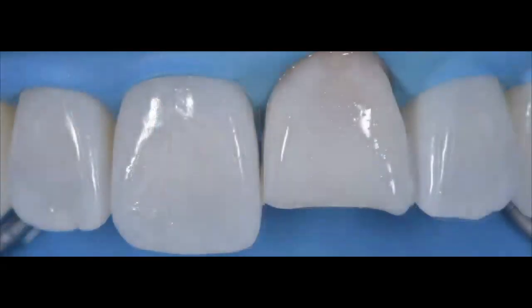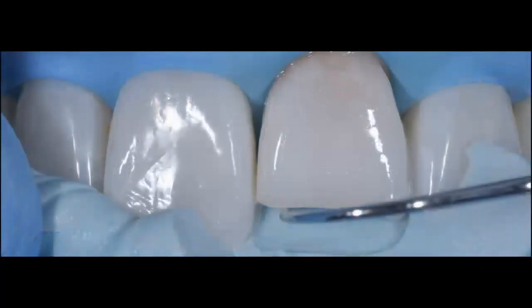So here you can see I've now placed my adhesive layer. I'm using my adhesive, and all I'm doing is placing that very thin layer of adhesive from the cervical all the way down to the fracture area. I want to make sure that I do that protecting the neighboring teeth, and normally I have a mylar strip when I do that. And then I'm going to use my lingual matrix and an explorer to mark exactly where that lingual matrix meets the fractured tooth surface.